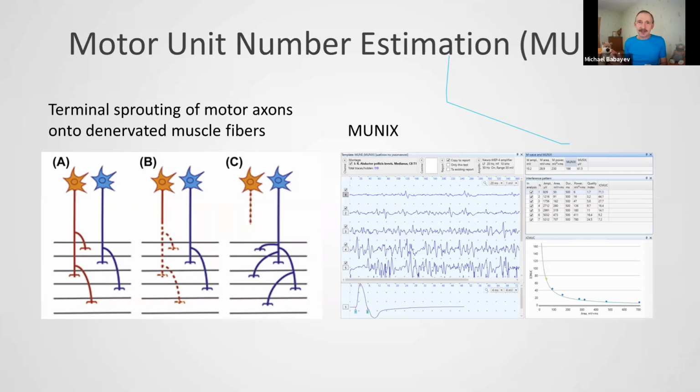It is fibrillations. They start fibrillations, and the nearest axon receives these signals and starts to grow a new terminal in the direction of this signal. This new terminal goes to the muscle fiber and creates a new synapse. So these muscle fibers will be innervated. This phenomenon has a name: terminal sprouting of motor axons. As you can see in the last picture, all muscle fibers are innervated.